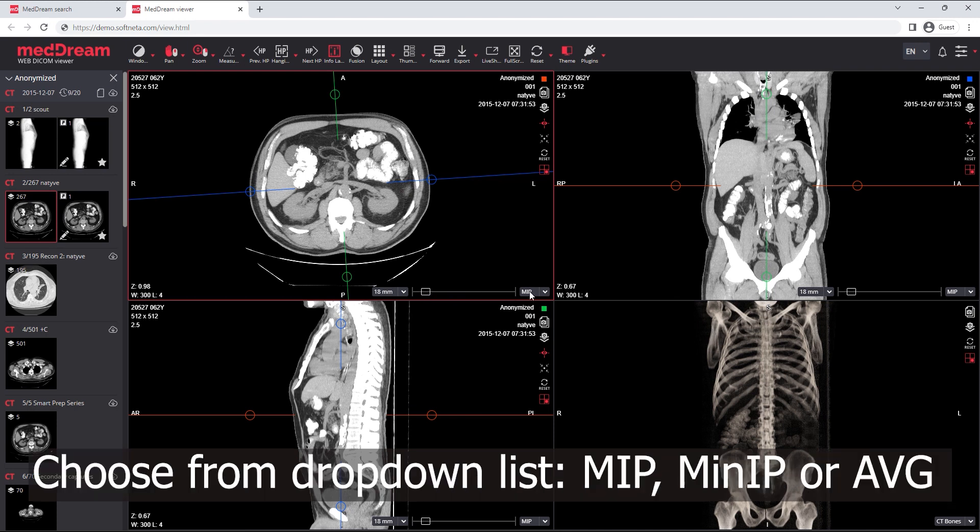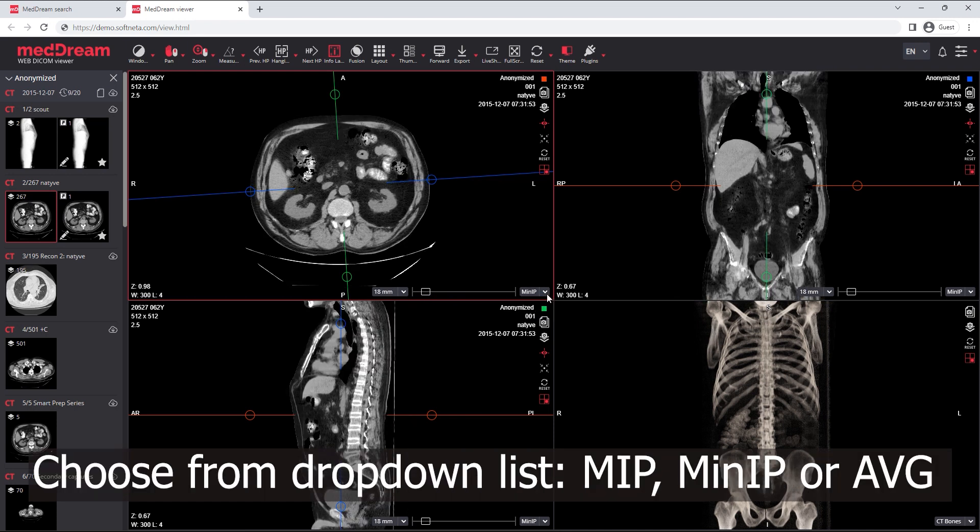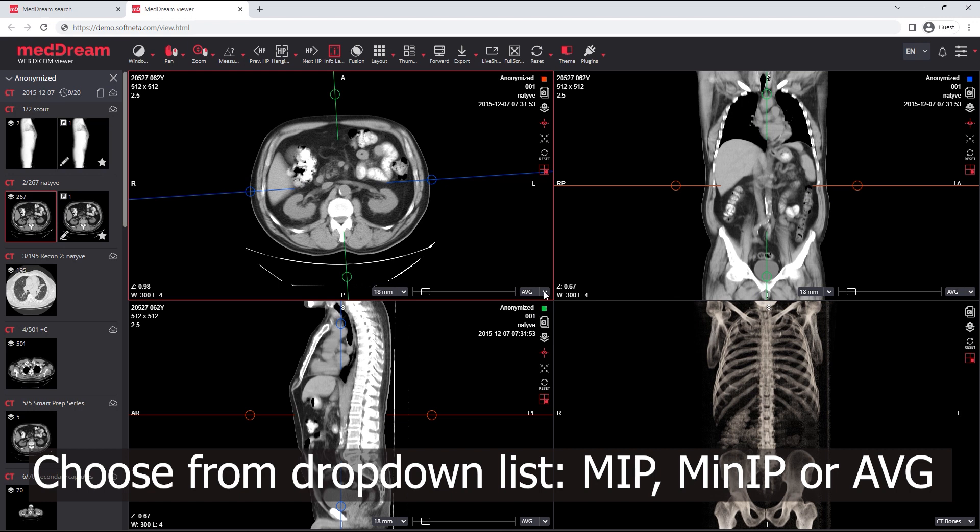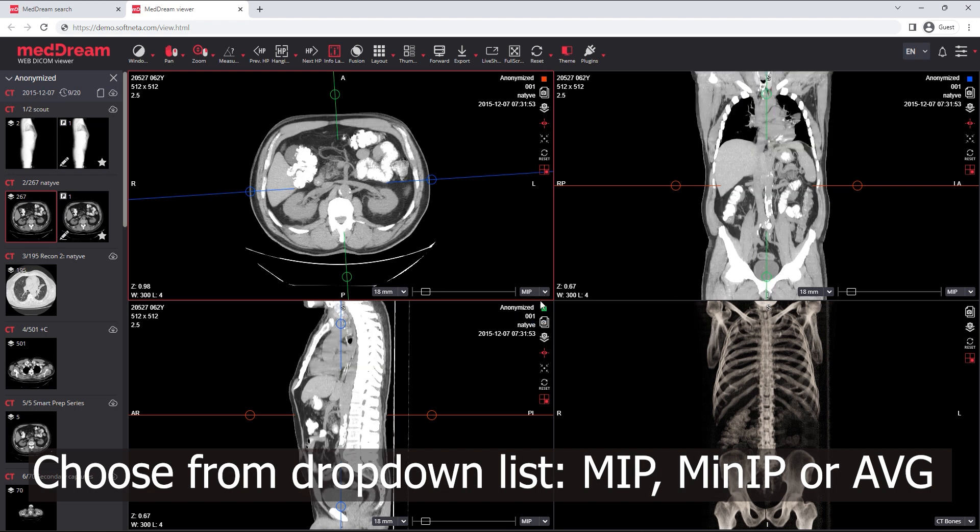Choose the image preparation method from the drop-down list. Select MIP, Min IP, or Average.